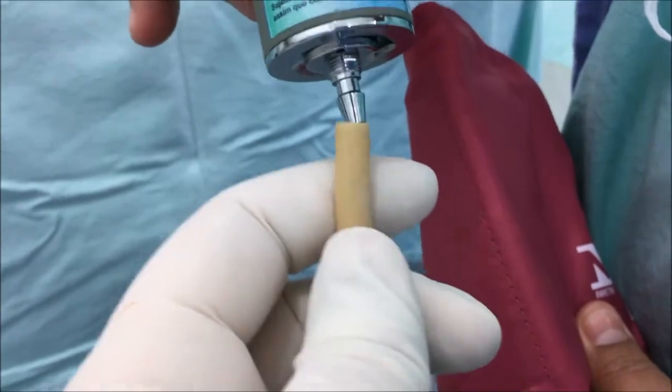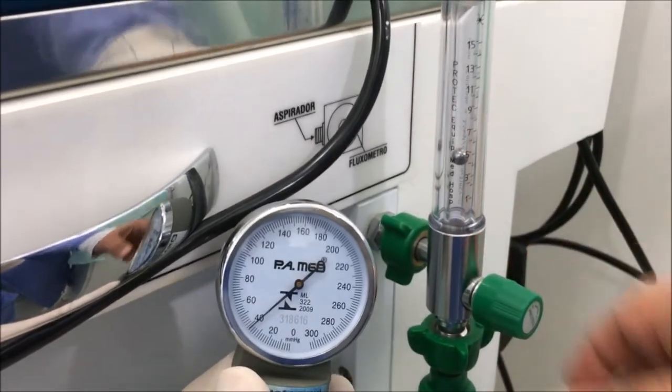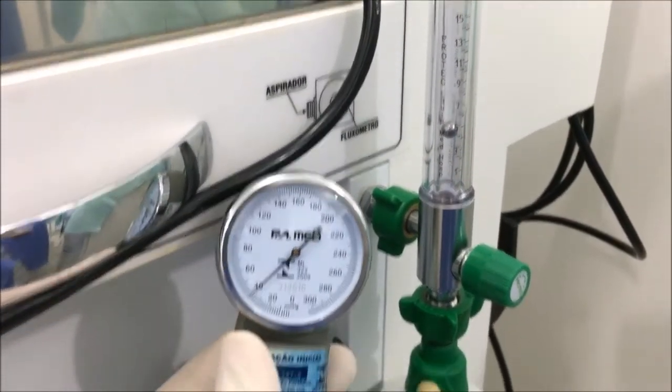We connect it to the tubing and here we use the O2 humidifier to adjust the pressure we want as a target.